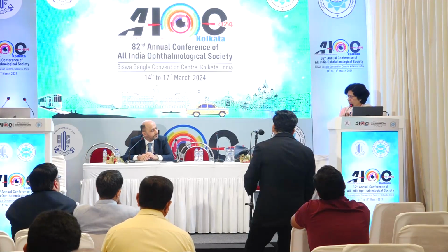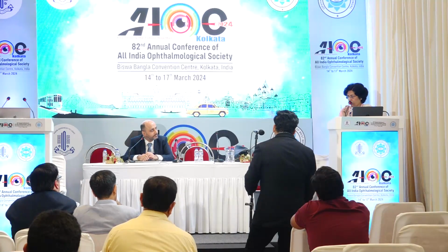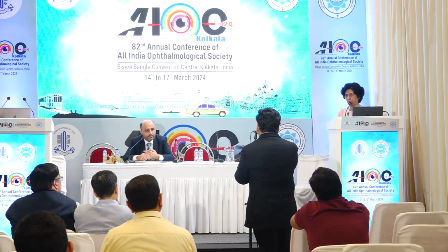I think for superior breaks or peripheral breaks, gas is quite okay. You can put gas. But sometimes if you have multiple breaks or if you have inferior breaks, then I don't think the gas will be that good. So oil would be a better choice. Yeah. For me, if I'm able to settle the retina and laser the breaks, I will prefer to do gas only. And I've removed all traction. That is the minimum thing. You have removed all the traction, I'm able to settle the retina, laser the breaks, I'll just do gas. If there are large breaks, like other indications of oil, I'll definitely go with oil at that time.